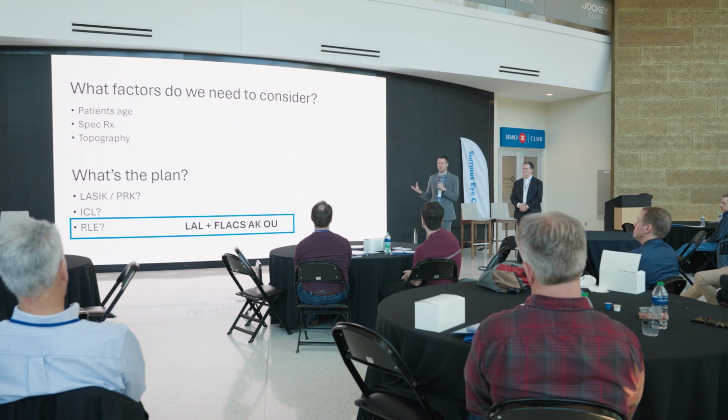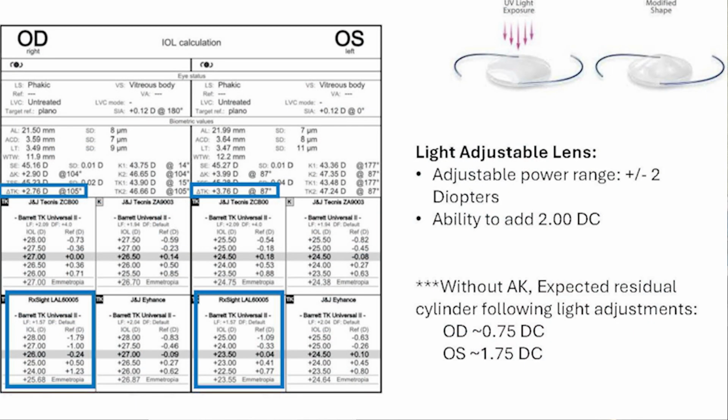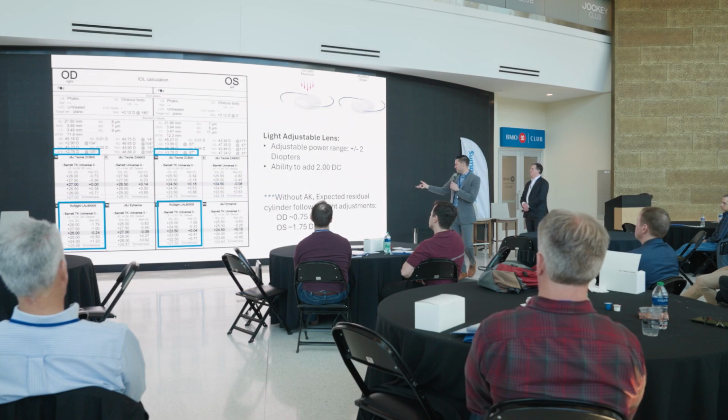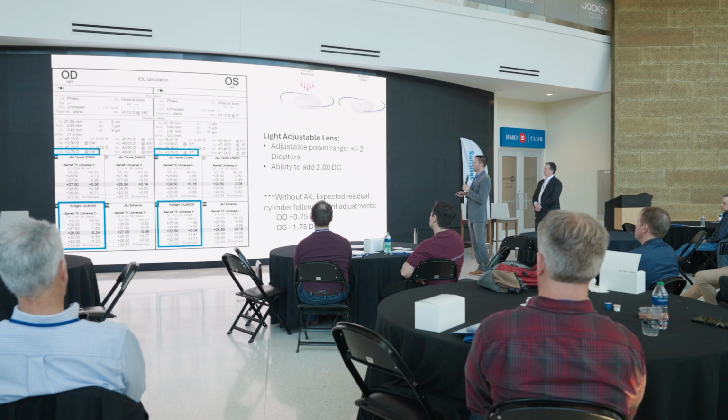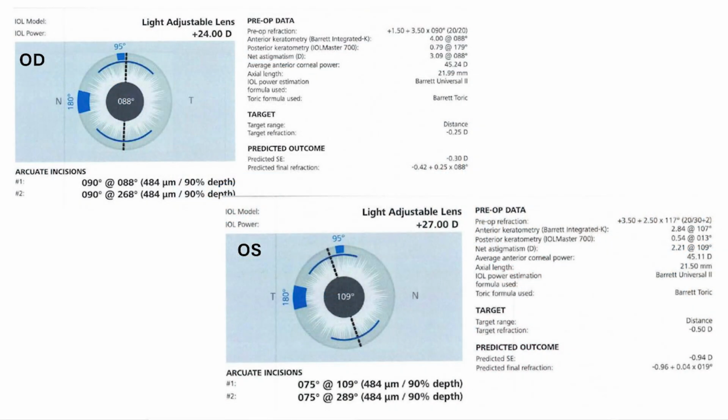So how do we tackle that? Well, we want to be accurate, number one, but one thing we can do is use the astigmatic keratotomies, the limbal relaxing incisions, to debulk the corneal astigmatism to bring the residual within the range of what the LAL could do. We were expecting about 0.75 to 1 1/4 or 1 3/4 based on all of our calculations. So this is what his plan looked like. Right eye, we're going to do a long arcuate incision along his superior and inferior limbus. Left eye, same thing, just along his steep axis on his topography that we took preoperatively.